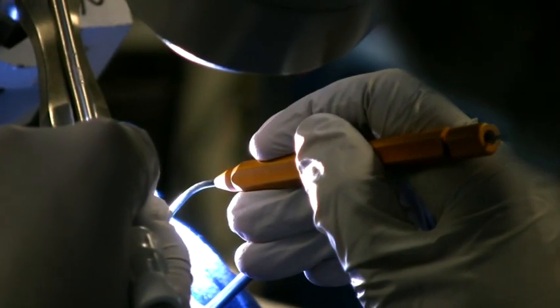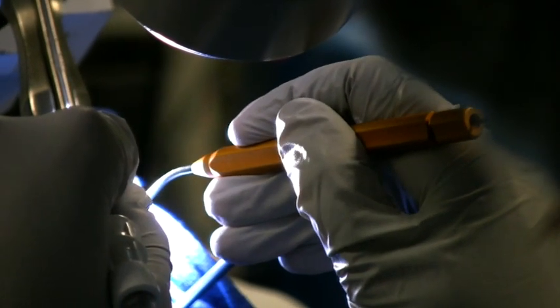It enables me to do more with limited exposure and difficult airway situations such as tracheal stenosis, glottic stenosis, and the fixation of the vocal folds. It just enables me to do this procedure a lot easier.